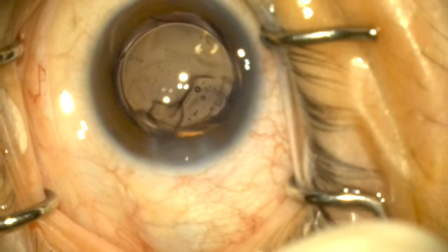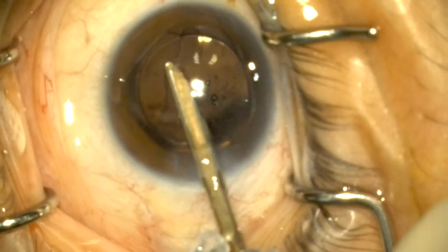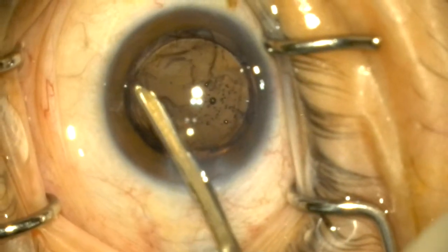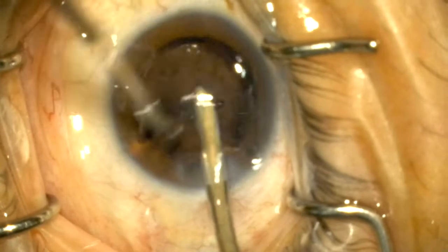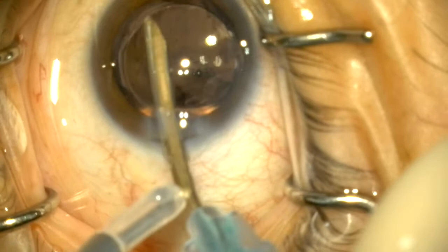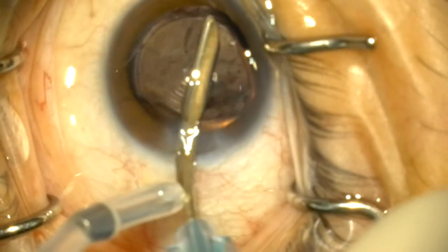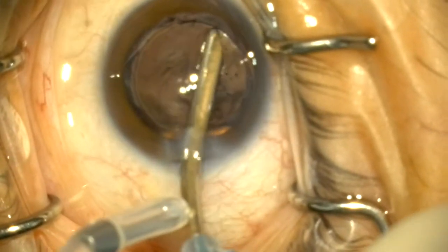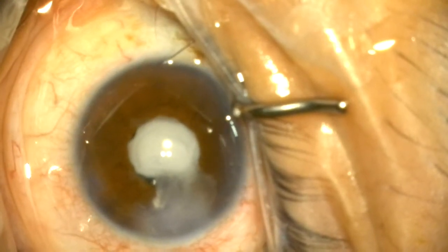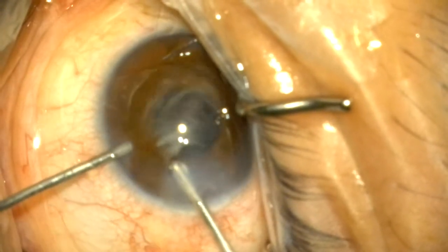Once the lens is in position, I remove the remaining viscoelastic with Simcoe. This is to make sure that I have a better control of the anterior chamber pressure and to make sure I do not pull the vitreous along. At the end of the Simcoe, I injected the patient with Miostat to constrict the pupil and look for any vitreous. I did notice there was some vitreous in the peripupillary area, hence I have injected some triamcinolone to view the vitreous in the AC. I then performed anterior vitrectomy, removing all the remaining vitreous in the AC.